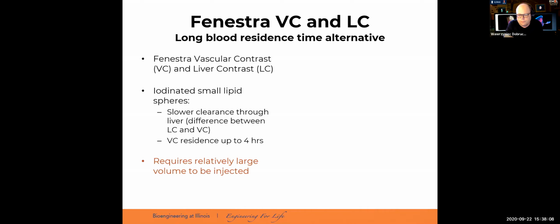It's a very good advantage because after injection of this contrast agent, it stays for several hours. It's not FDA approved, so it cannot be used in patients. However, it was successfully used, also in my research group, to image using preclinical systems in experimental animals.